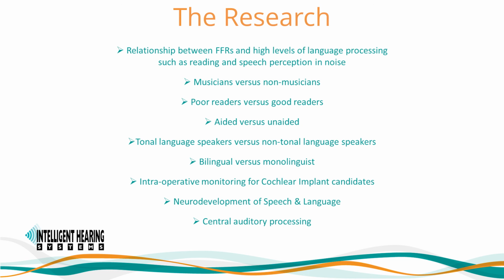Anderson et al. showed FFR fundamental frequency F0 and formant amplitude improvements in aided versus unaided individuals, thus its potential role in assessment and management of hearing impairment. Krizman et al. studied individuals fluent in tonal languages versus individuals not exposed to tonal languages in sleep and found more robust responses for tonal language individuals. This demonstrates the importance of the language experience for individuals in processing sound.